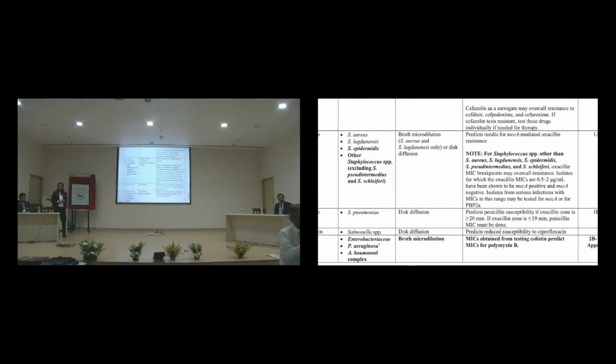First one, you can remember that if you come across Staph aureus resistant to a drug, without testing it, report that drug as resistant. The problem already mentioned is the resistance between the aminoglycosides, for example gentamicin and tobramycin, which all have similar enzymes which change them, with the exception of amikacin. But be aware, because if you use them clinically, the strains resistant will develop further resistance. So normally, clinically, you should not recommend it.